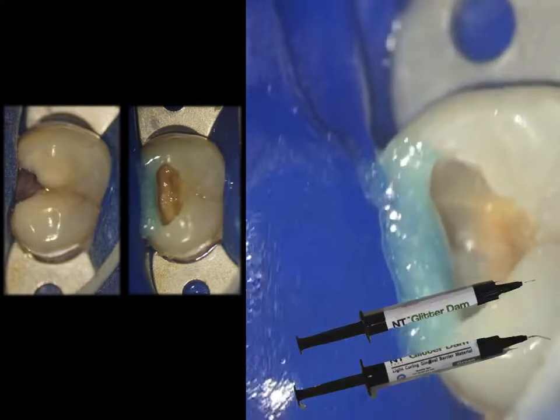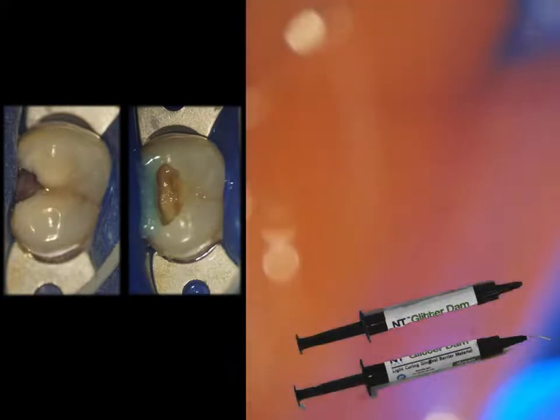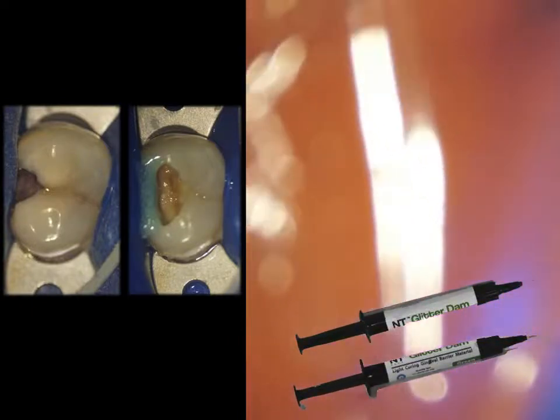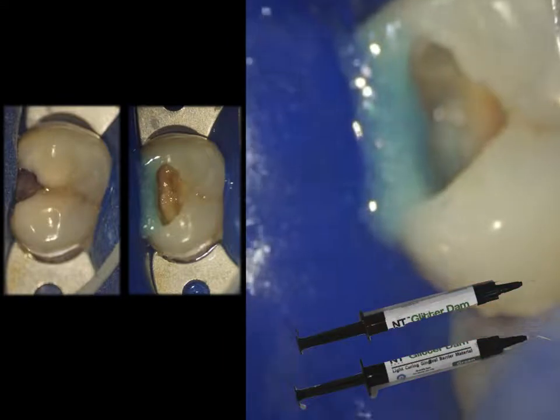That creates a proximal wall which seals the exposed side. After the light cure, we have a ready proximal wall. Now we can go ahead, refine our access opening, expose the canals, and complete the root canal treatment very effectively.